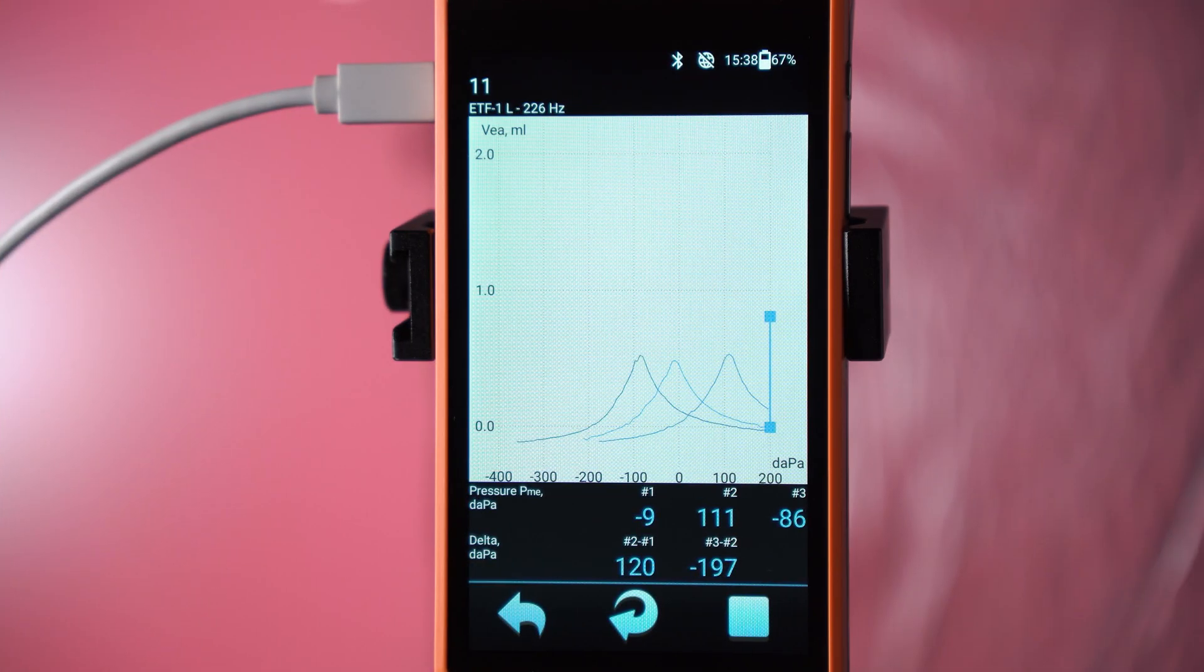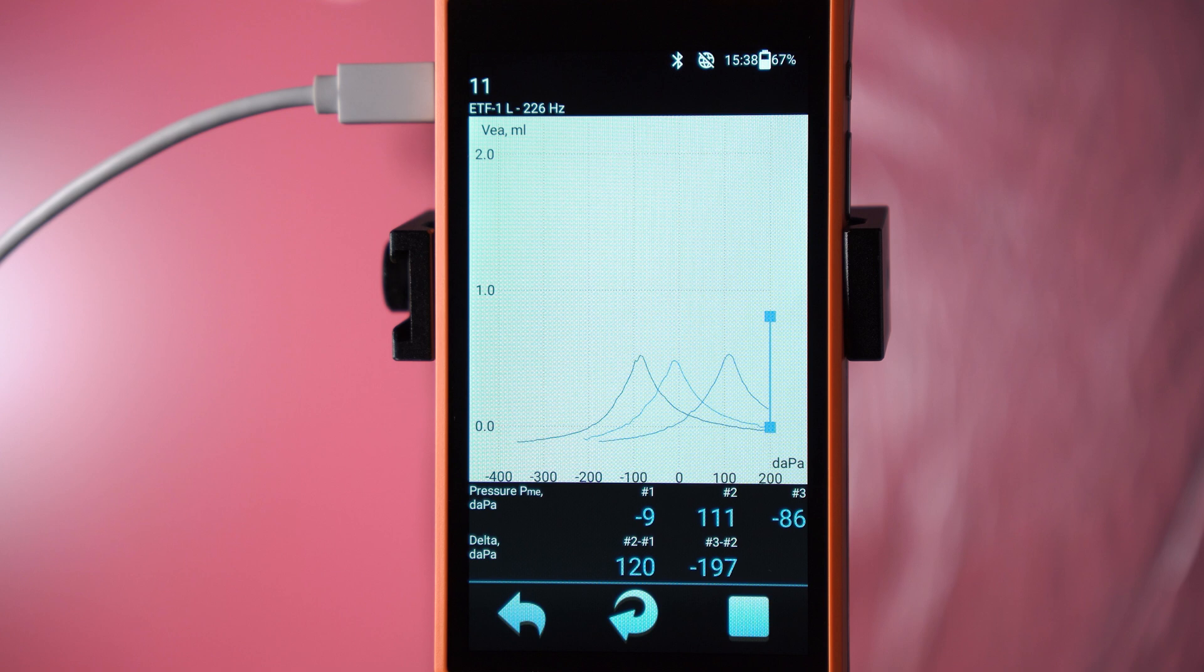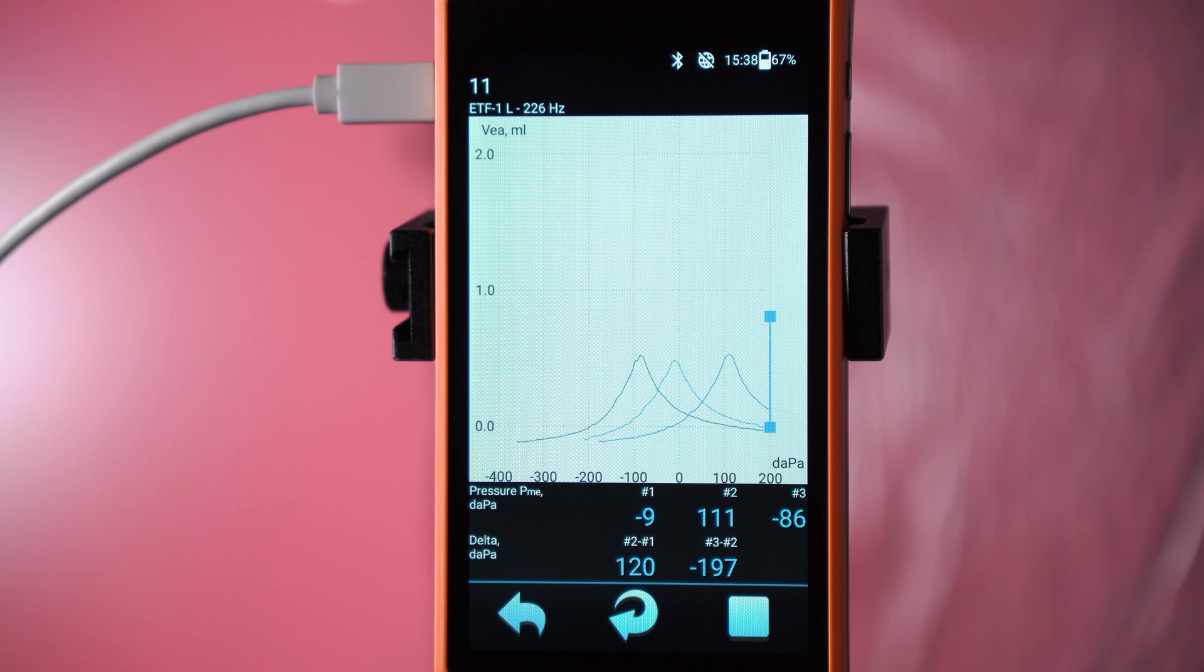All three tympanograms are in one test, allowing the doctor to visually assess the graphs' mutual positioning. Below, on the black field, information about the peak pressure of the maximum eardrum mobility for the first, second, and third tympanograms is indicated. For convenient assessment, the difference in peak pressure for the second and first, and third and second tests is automatically calculated on the bottom line.